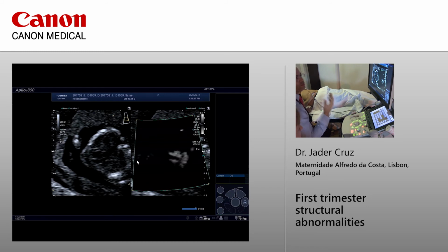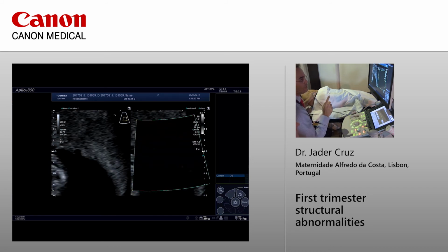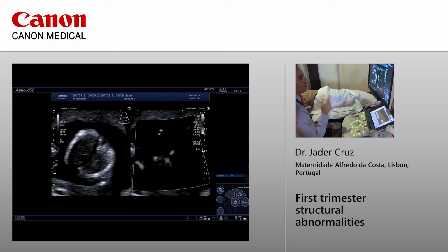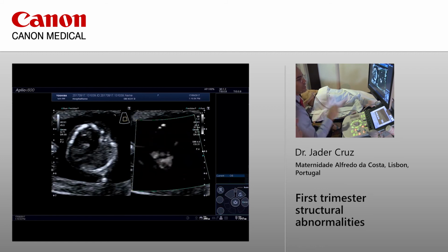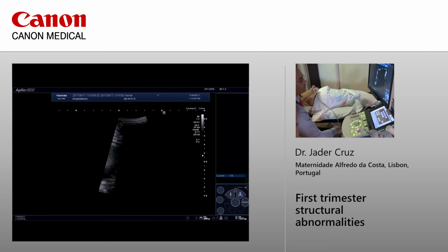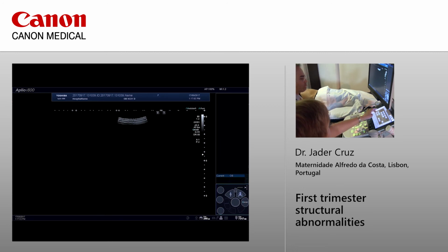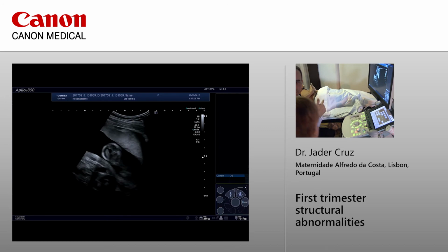For example, if you are in a transverse view and you want to see the Doppler here, the Doppler doesn't show very nicely, but the SMI does. Although it's the same Doppler signal, the algorithm reads it differently, so you can actually see better. Just going to carry on, and then we come back to the heart later. Or should I just keep looking at the heart?